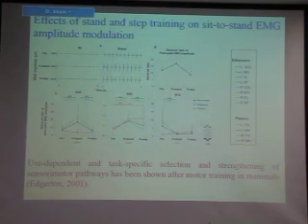And so one way to look neurophysiologically at this spinal cord plasticity is, for example, to deliver stimulation at a very low frequency. And what we have done in this case is compare the amplitude of these evoked responses in sitting, where the subject is relaxed and no motor tasks are performed, so comparing the sitting to standing responses, again with the same stimulation parameters.